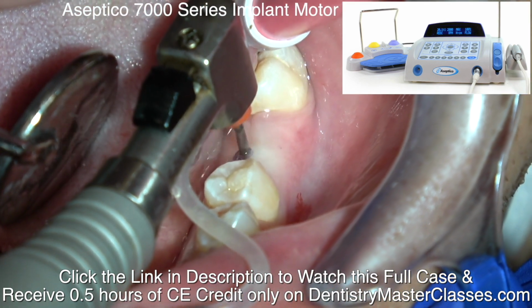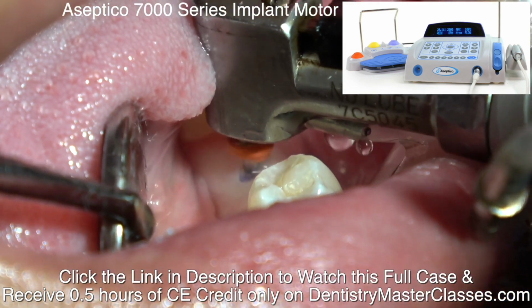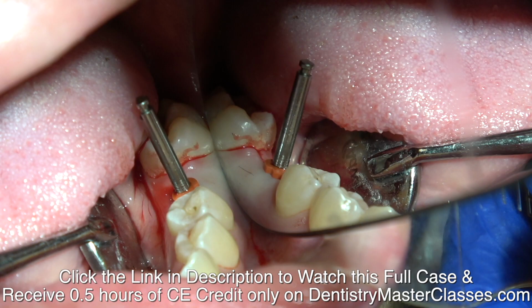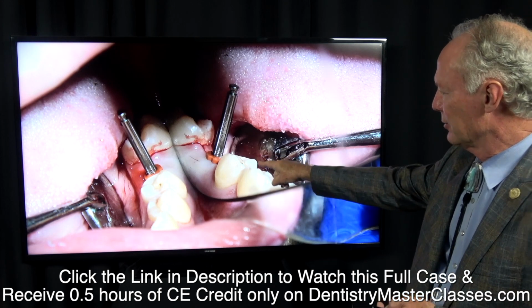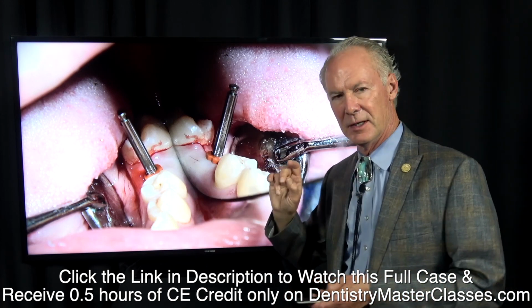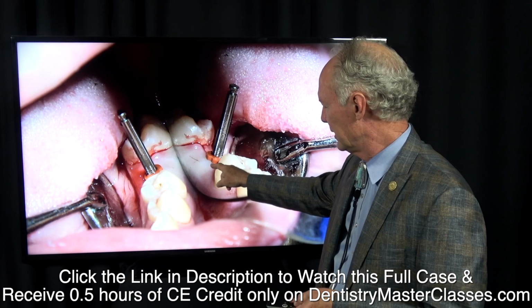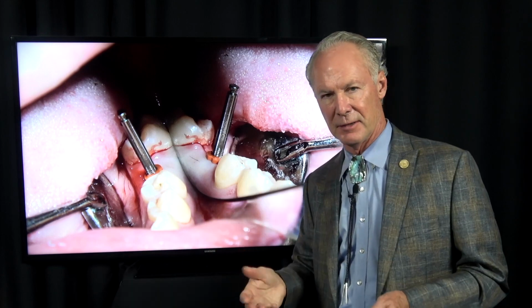So here's my rubber stop, here's my pilot drill, and I'm going to drill 14 millimeters. I want to stay a couple of millimeters away from the inferior alveolar nerve. If you take a periapical radiograph, that's a 1-to-1 ratio. You can see the rubber stop is on the gingival tissue. If this is 15 millimeters from the rubber stop to the tip of the pilot drill, you've got 2 millimeters of gingival tissue. So if this is 15, that means the part of the pilot drill in the bone is 13. So we had 15 millimeters of alveolar bone from the crest of the alveolar bone to the tip of the roots. That's where the nerve is.